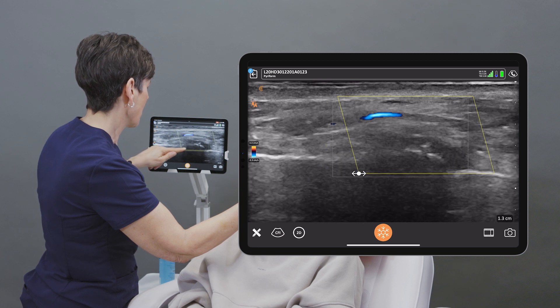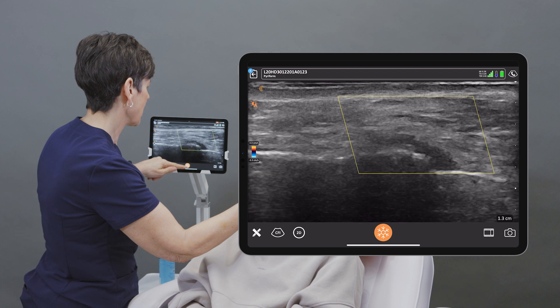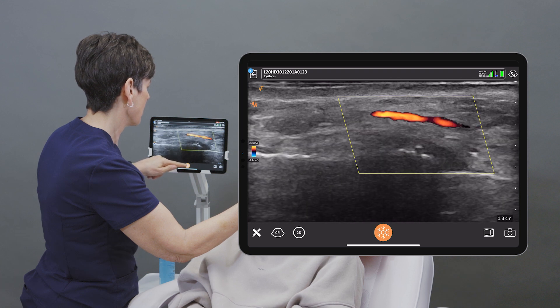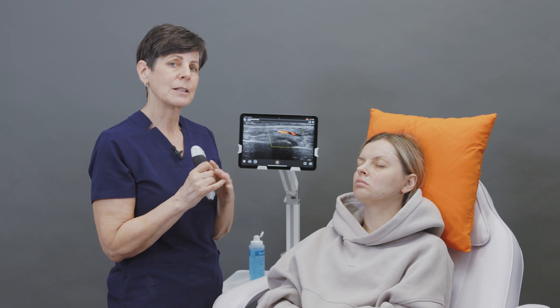So what I can do is steer the box in the other direction and now we can see the arterial flow really nicely. Steering the color box can be helpful when you have a blood vessel that's coursing straight across the screen — it just helps you get a little bit better color sensitivity within that vessel.